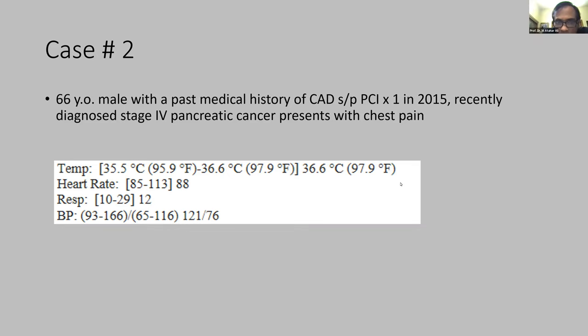Again, regarding your first case, that is without EP study, the indication was class 2B, but after EP study, it became class 1. It definitely became class 1 or class 2A. I don't know exactly if it is 1 or 2A. I leave it, Rafique bhai. It is a class 1 for HV more than 55. Okay, what was the HV? 100.